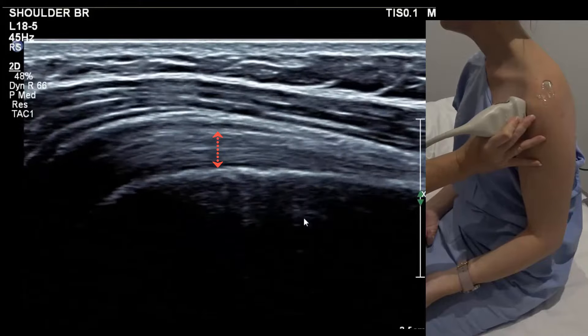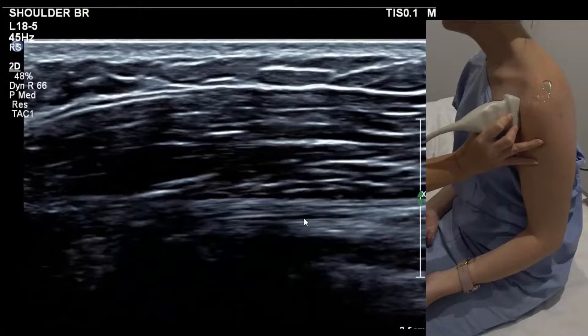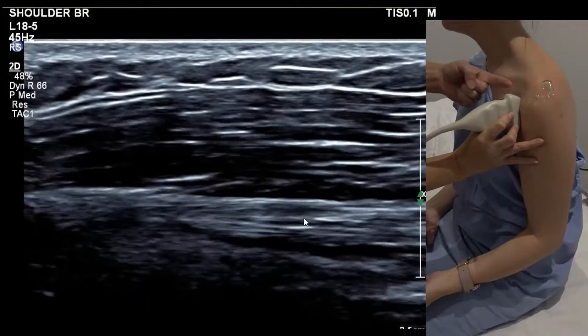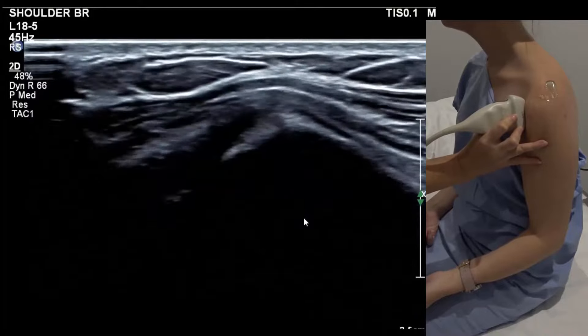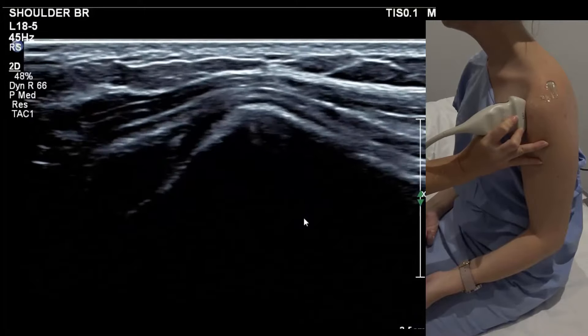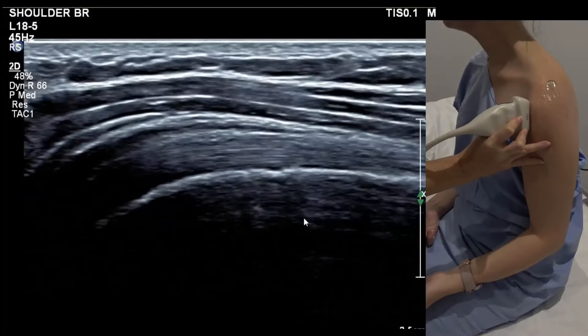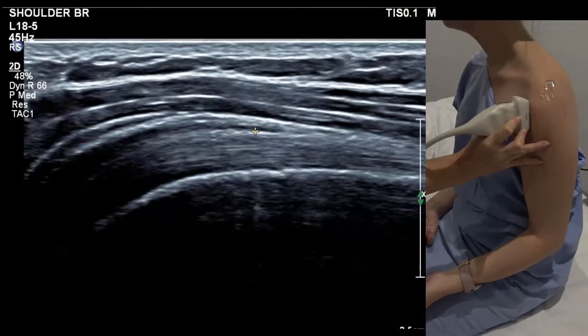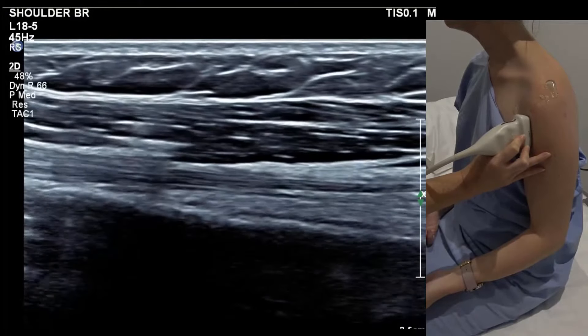In the longitudinal view, a good way to find it is to go medial in the true long axis of the body and then slide back out laterally until you see a bony lump — that's the lesser tubercle. Once you're on the lateral side of that, you fall neatly into the bicipital groove. With nice parallel white lines, we can measure the biceps to show the radiologist what you're looking at.